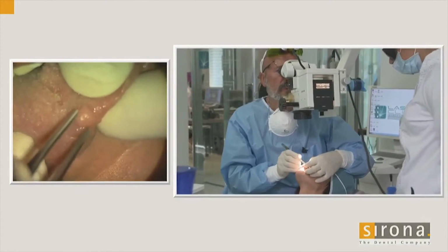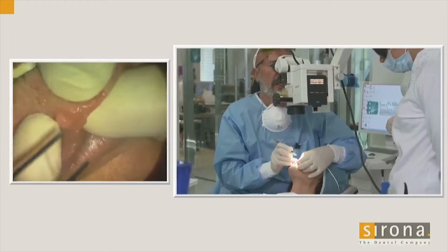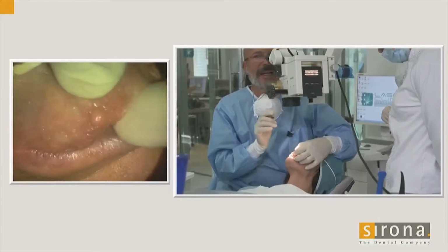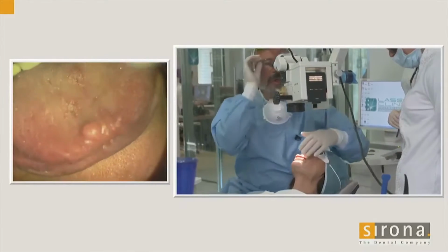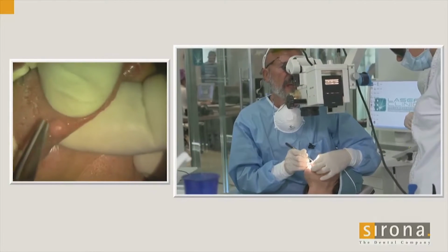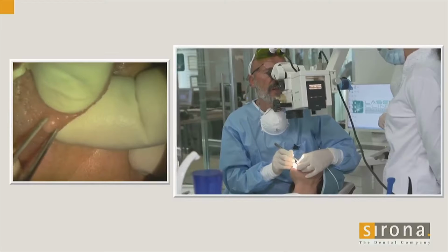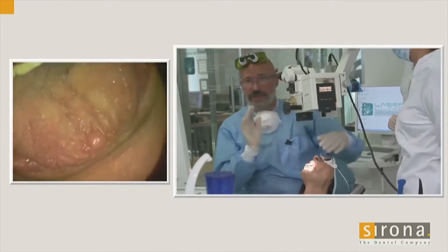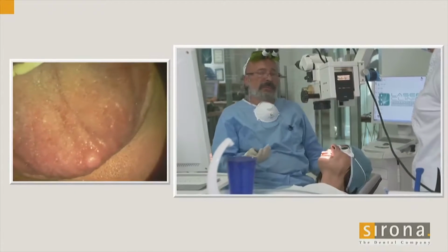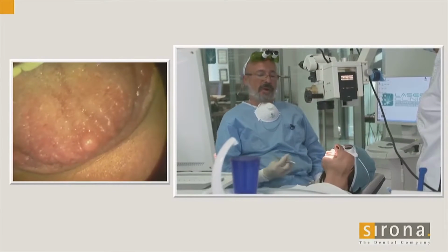We have to consider it as a lesion now, and we want to take this lesion to analyze after the procedure. So the line of a cut will be only in the healthy tissue, not in the lesion. So I will stay 1 or 2 millimeters far from the lesion when I cut this lesion. This is very important, as this fibroma is a common benign scar-like reaction to persistent long-standing irritation in an area of the oral cavity.